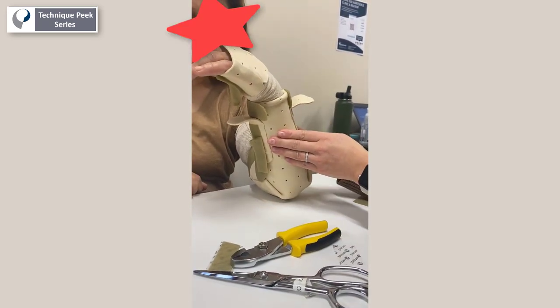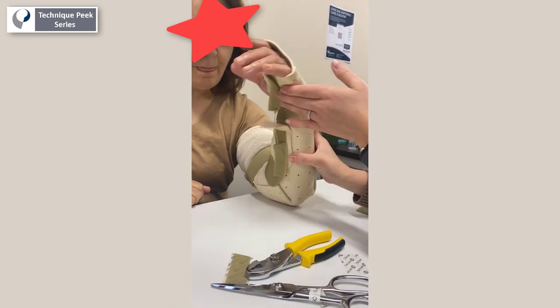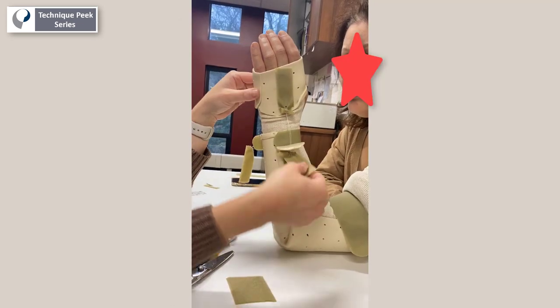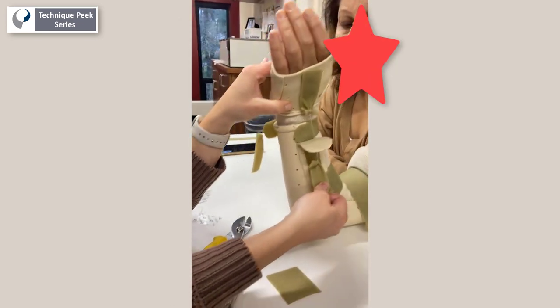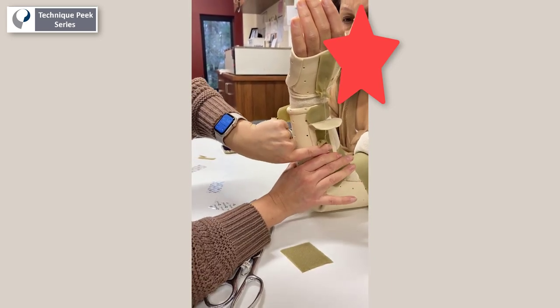In this part of the video, the patient is statically and progressively stretching her wrist into flexion. Next, we will see how to use the same splint to gain extension. Moving to the back end of the splint and pulling down on the back strap, we can work on wrist extension using the same splint as we worked on flexion.